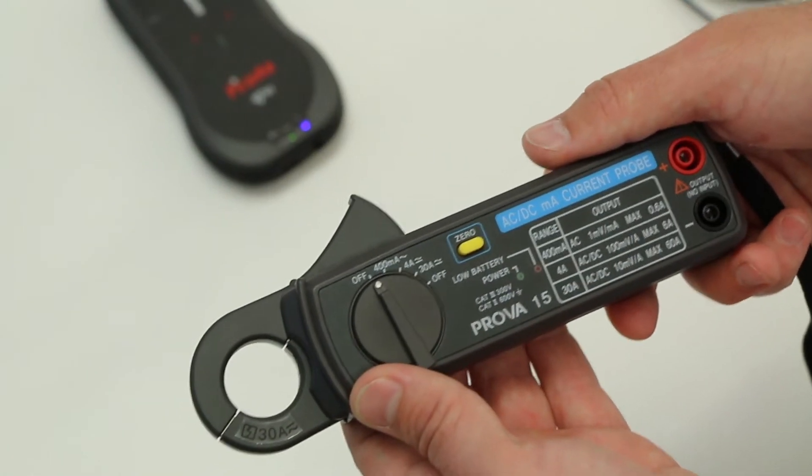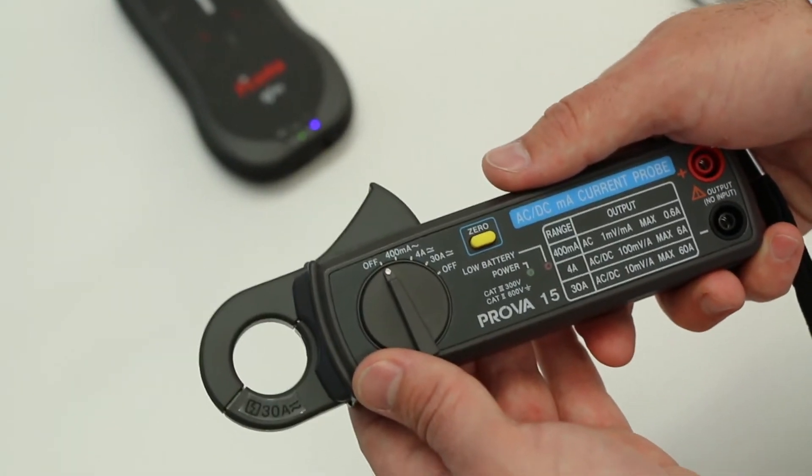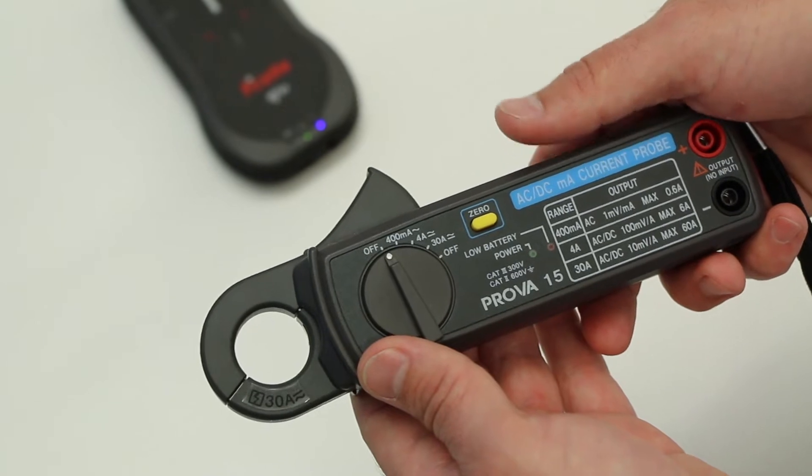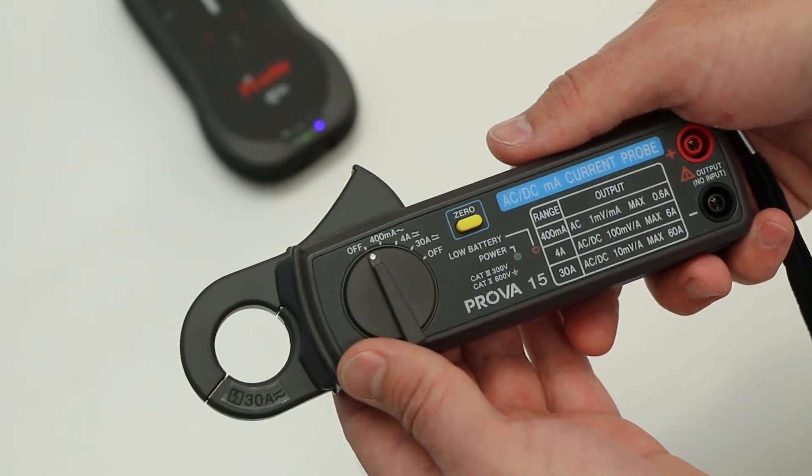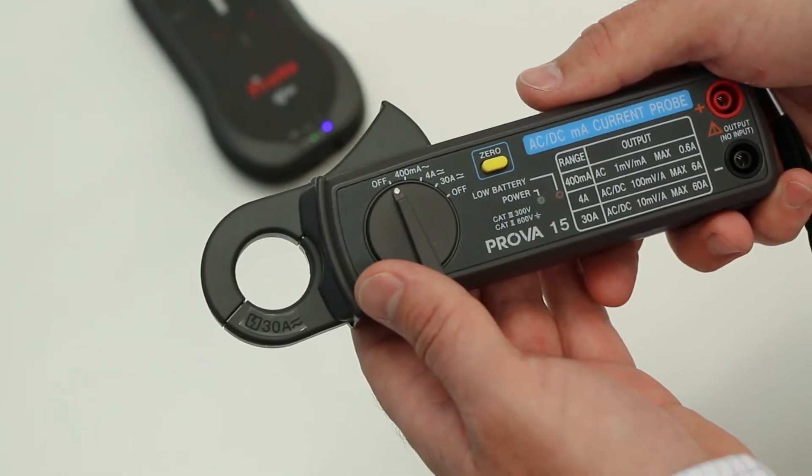Hi, I'm going to show you how to set up your Piranha system for non-invasive mAs measurements. The Piranha MAS-2 is a current probe to use together with the Piranha. It provides an easy way to measure tube current and tube charge without having to connect to any physical test points on your x-ray equipment.